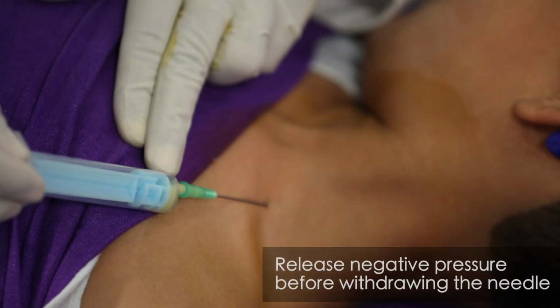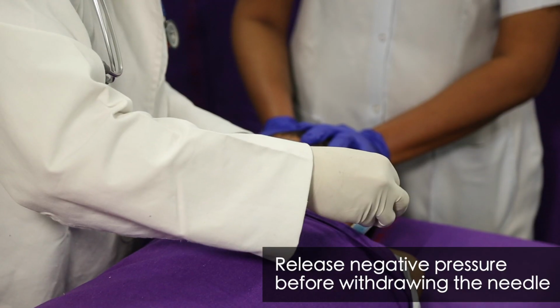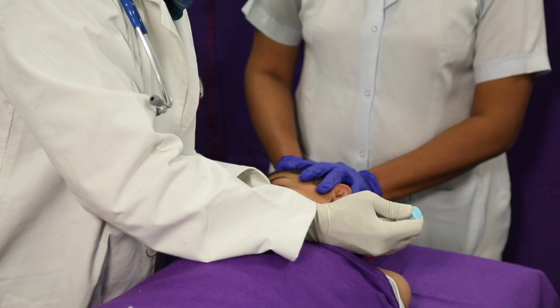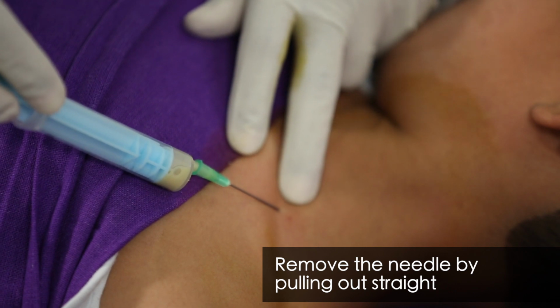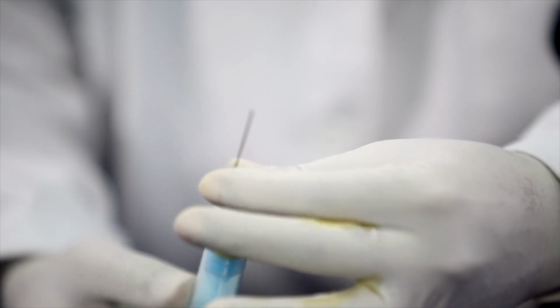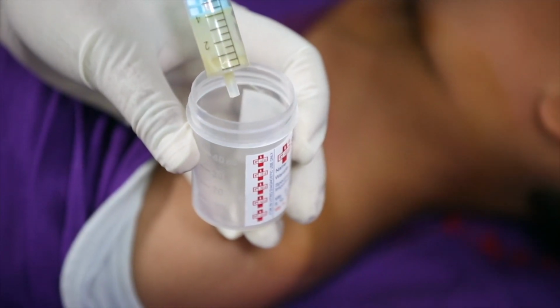Prior to withdrawal of the needle from the swelling, negative pressure must be released. Remove the needle from the swelling by pulling straight out so as not to lacerate the skin. Remove as much aspirate as possible from the swelling.